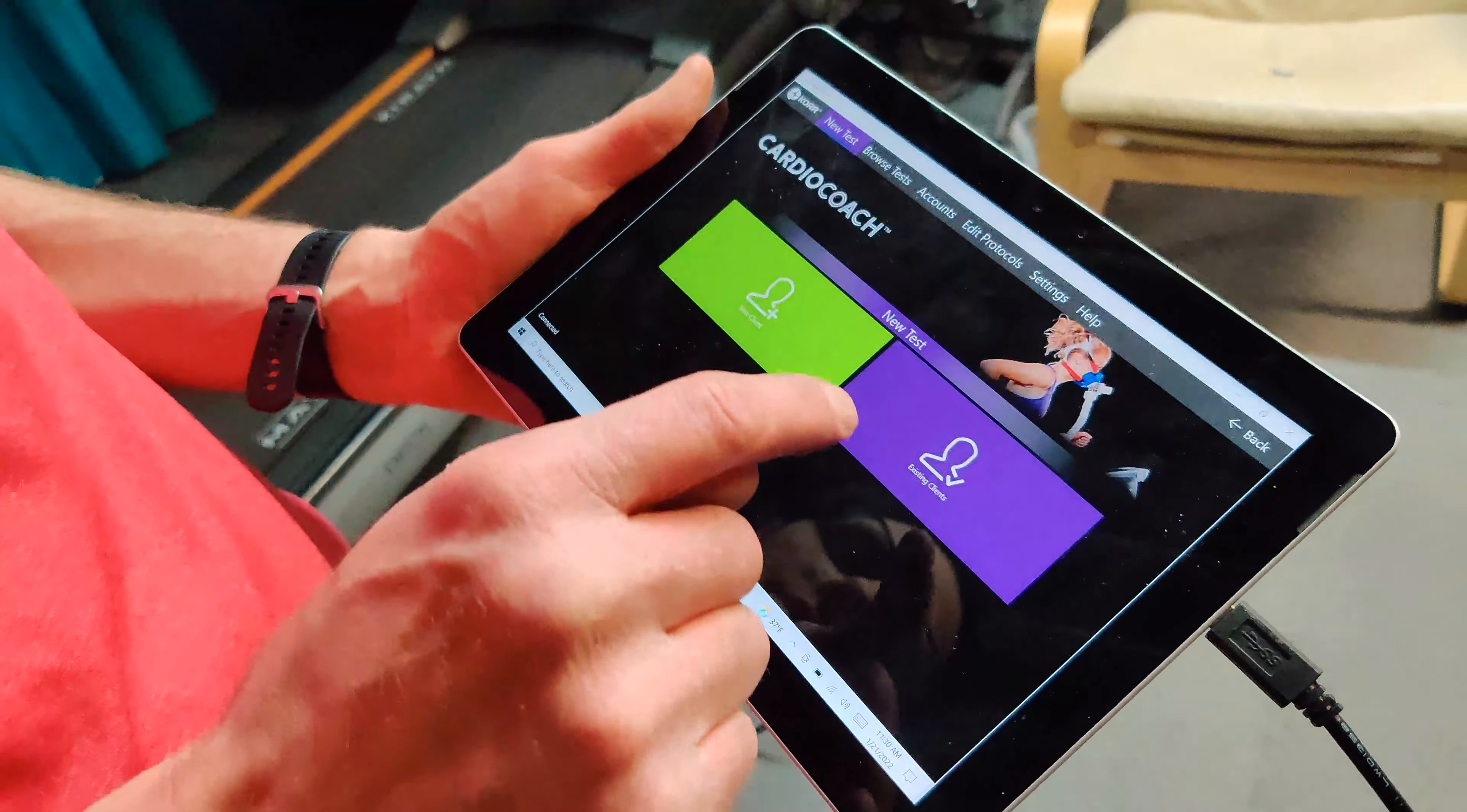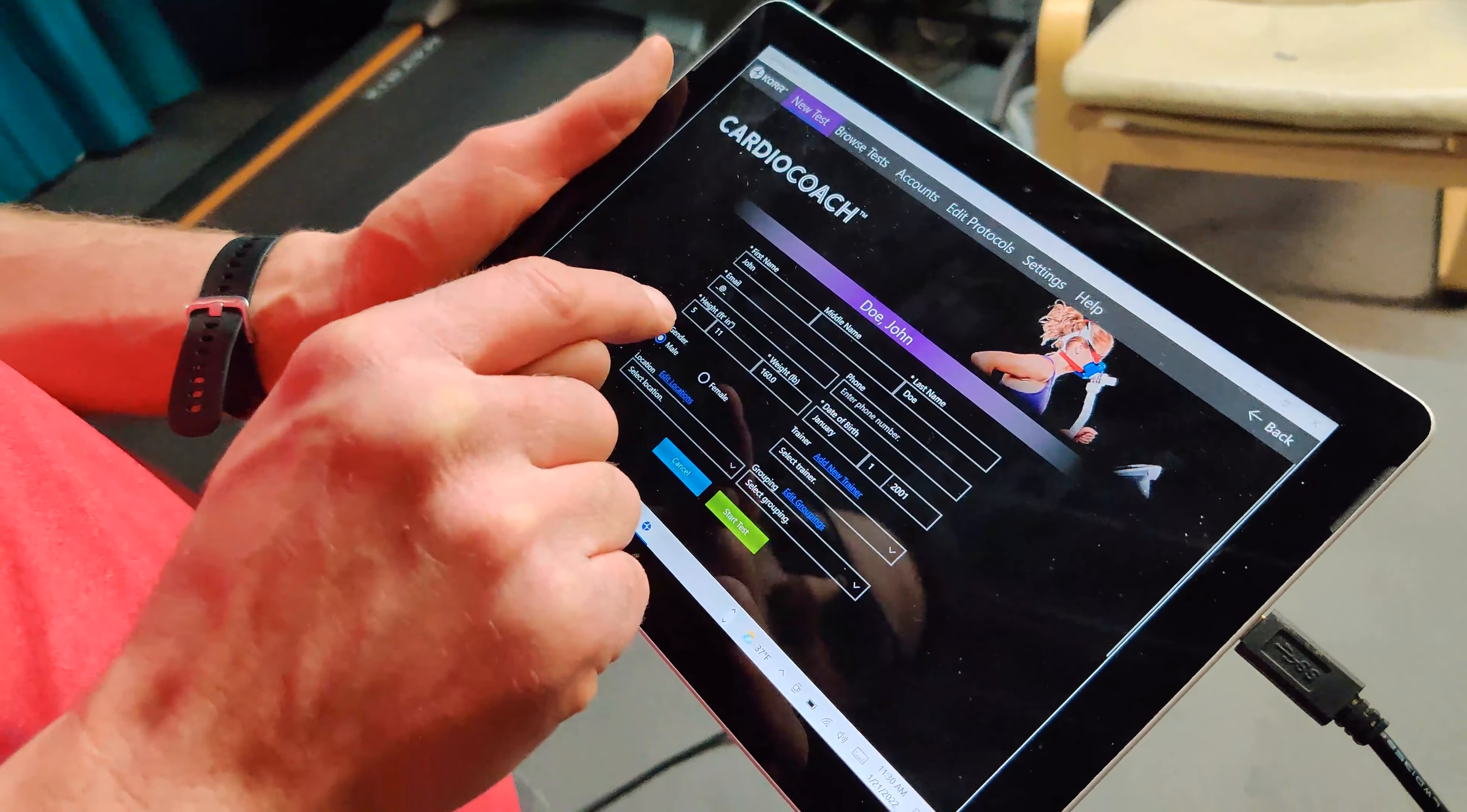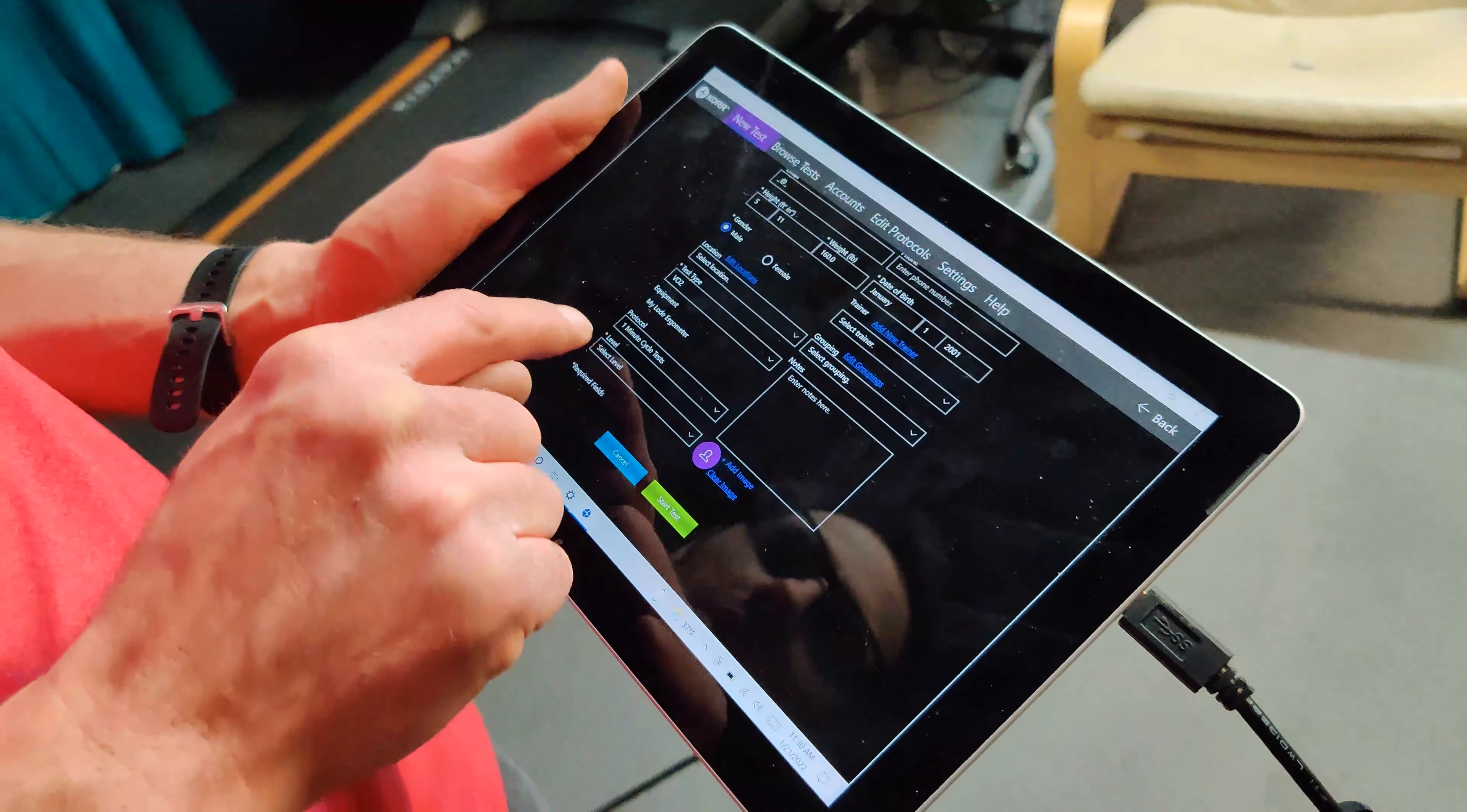To make sure the load is connected, start a new VO2 test. Be sure to select a protocol before starting the test.